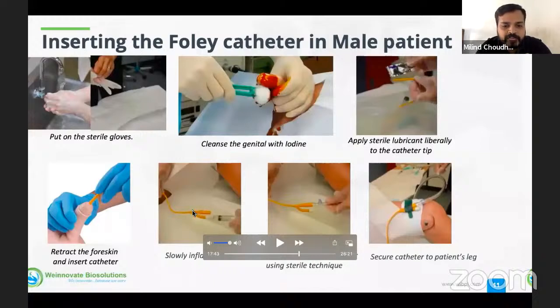The second port that you see is actually the tube which is coming from the bladder, and the eye is punched to this tube. The attachment that you see here is a urine bag attachment. Typically from the eye, the urine is drained across the tube and comes out through this tube. So from an infection point of view, this is the most important tube.